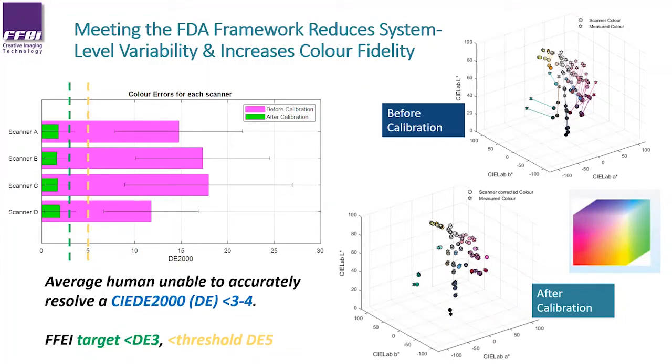In addition, scanner colour is part of the end-to-end pipeline, from patient to tissue to diagnosis, on a monitor or by AI. It's therefore important that colour fidelity is maintained to map and align the digitization process of real tissue colour as it is presented to a digital pathologist, as shown plotted on the right.